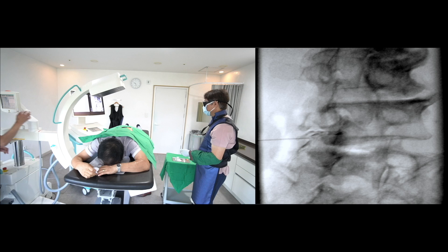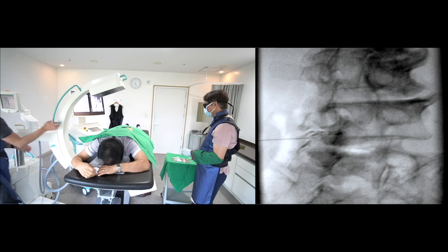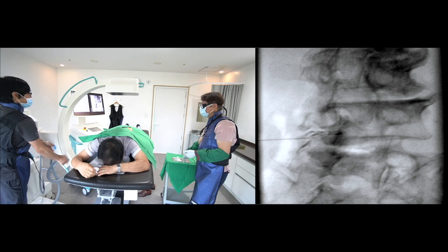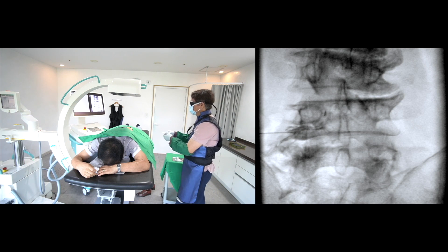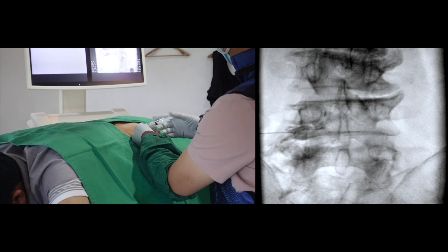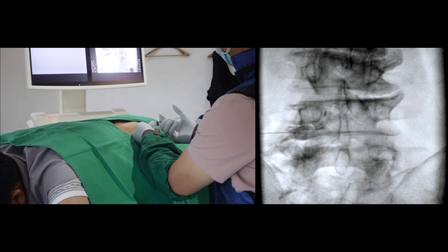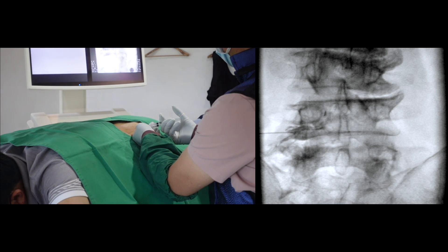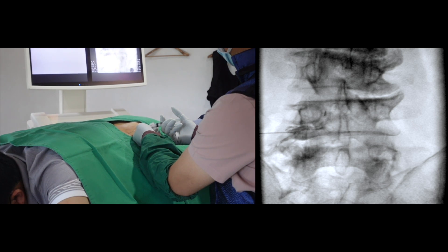My patients complain of more pain when the contrast spread shows intra-neural infiltration than with perineural injection. Therefore, I tried not to administer the drug if the patient indicates it is painful. I withdrew a little and the patient did not feel pain, so I will deliver the steroid mixture carefully while monitoring the patient's responses.